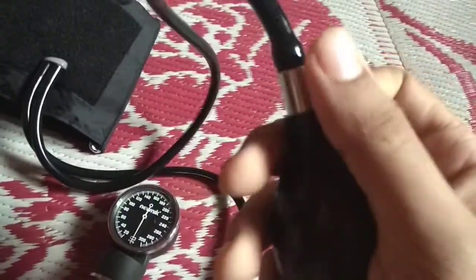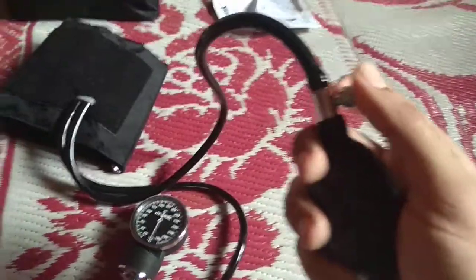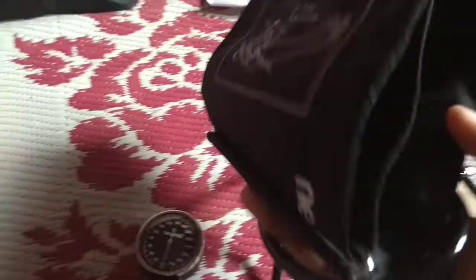But you have to keep this tight, because if you do not keep it tight, whatever air you put in will not go into the cuff. The cuff can adjust to the size of any hand.